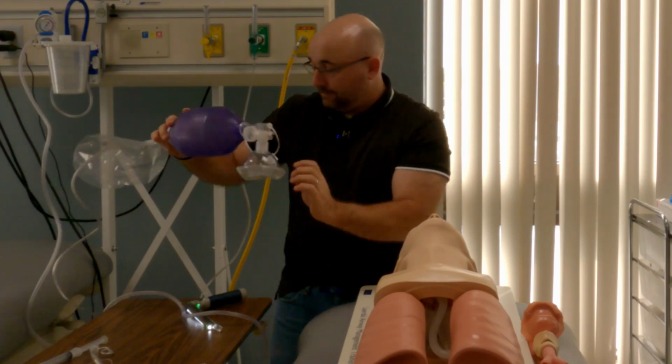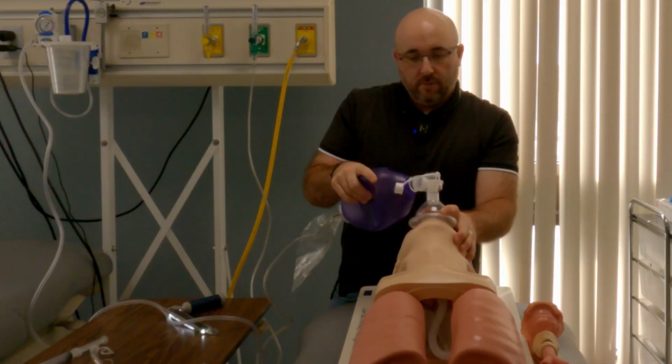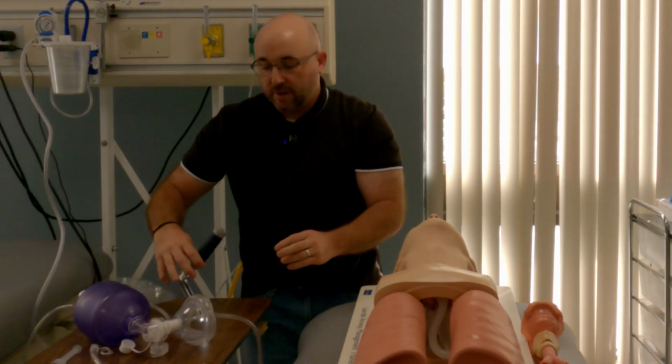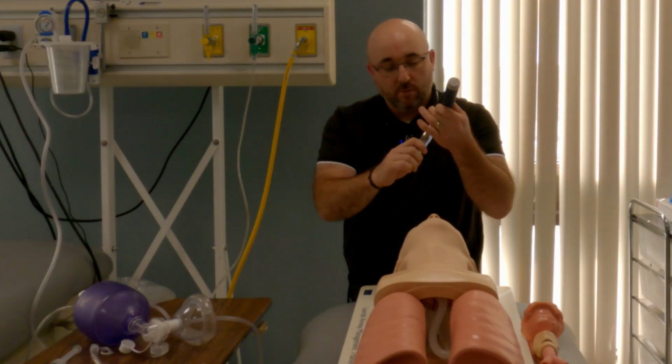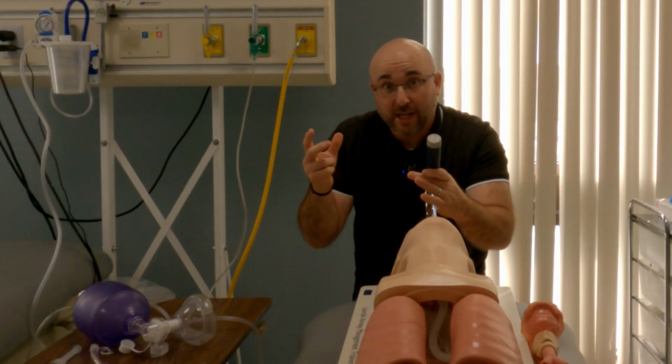We're going to ventilate. Okay. Patient sedated. We're ready to go. This goes down. Laryngoscope blade and handle come out. We open it up. We take a look. Oh, what do you know? We need to suction. Waiting for suction right here.